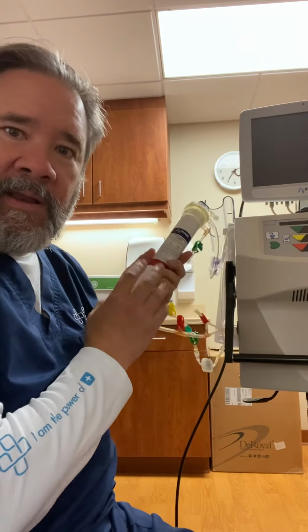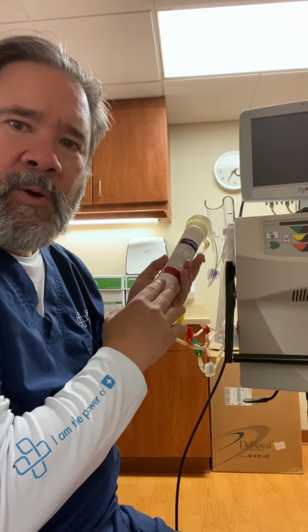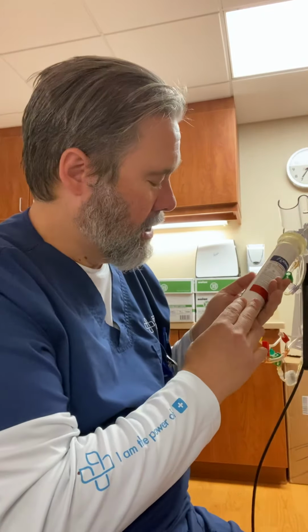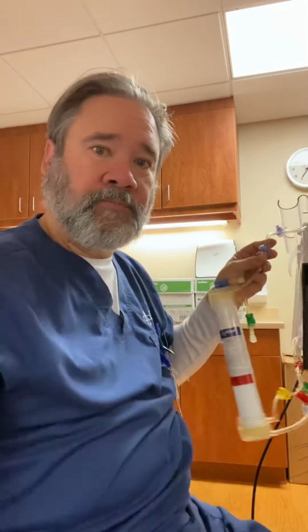We know that our normal ionized calcium in this filter should be 1 to 1.6. So if our ionized calcium is 1 to 1.6, the clotting is really unlikely. But how do we know? Well, we're going to check here at the blue port.